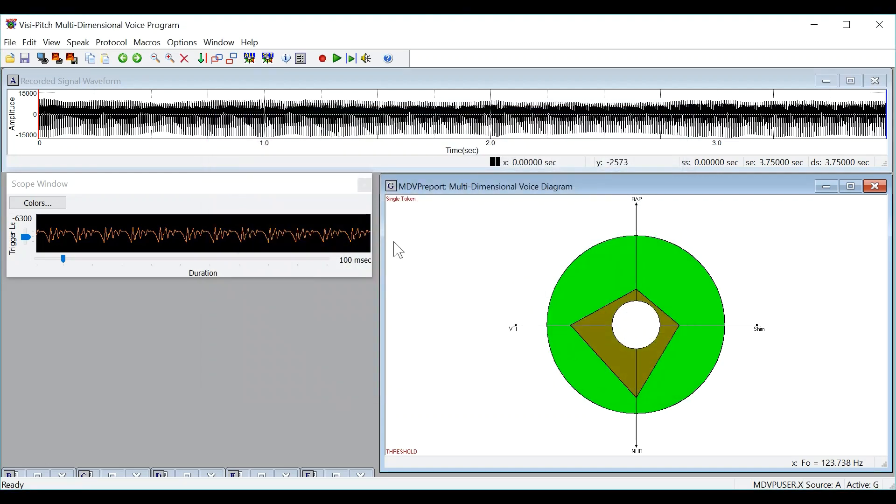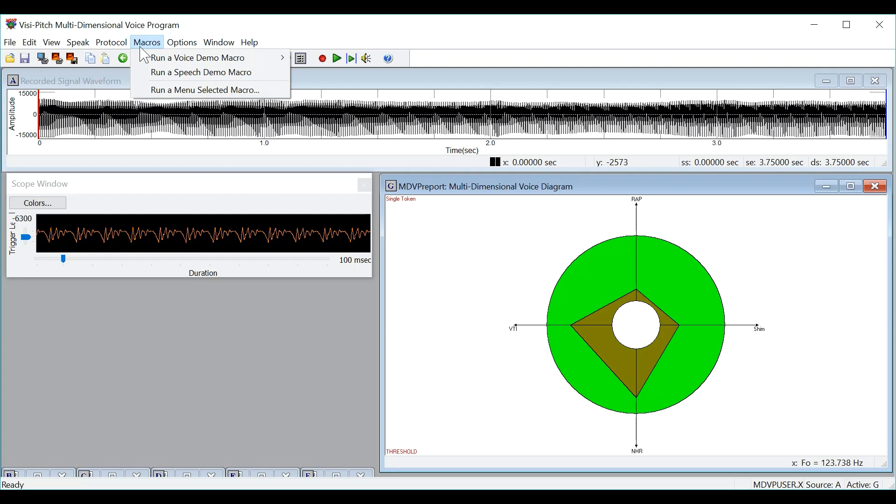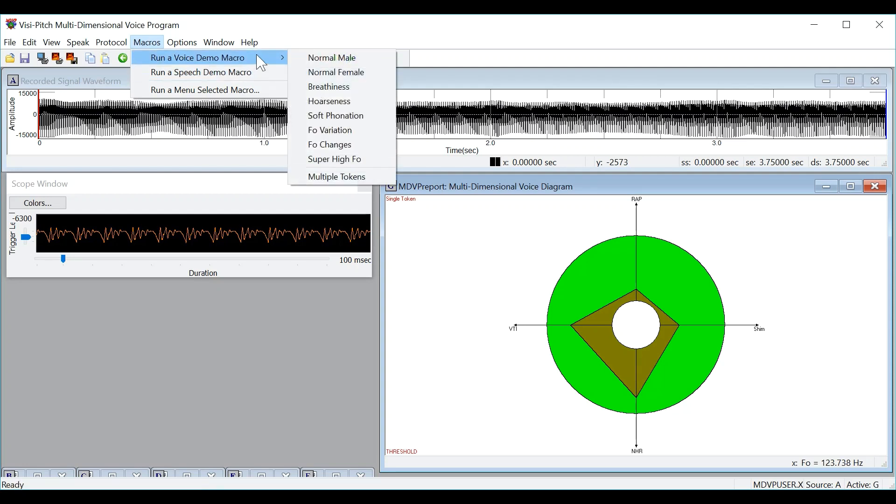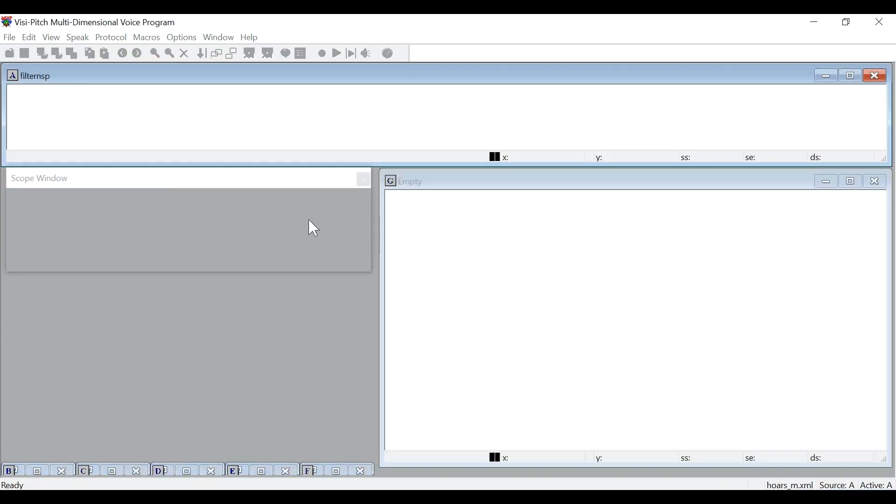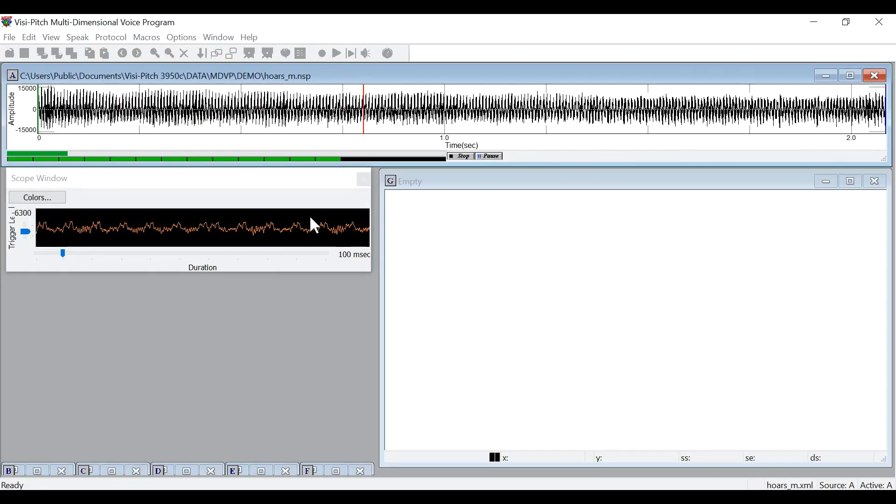Let's now do another analysis that shows values outside of the normal range. We will go to the macros menu and run a hoarse voice macro to see a sample outside the normal range.